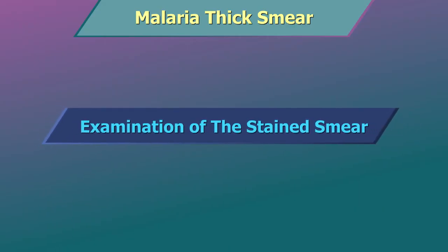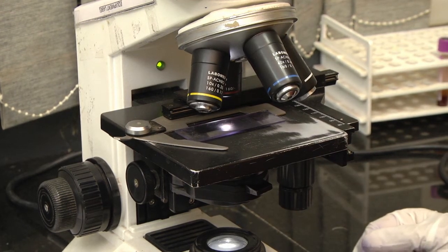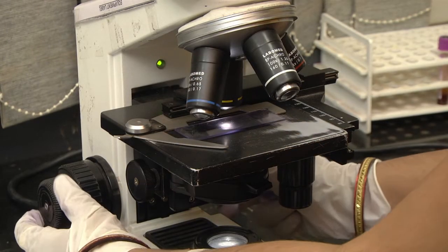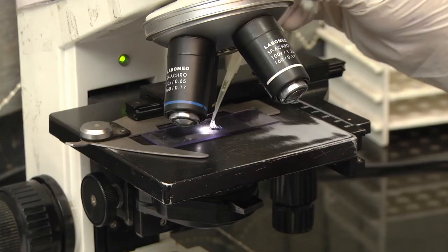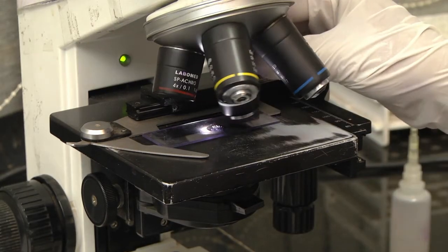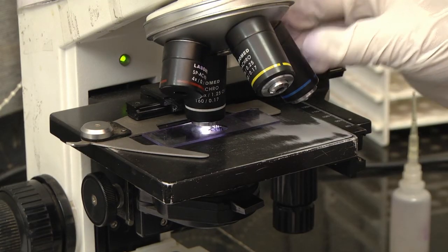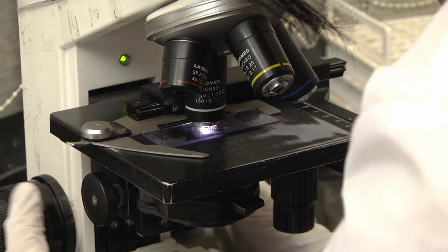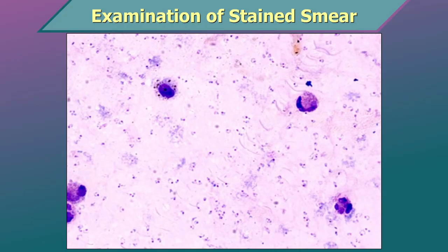Examination of the stained smear: place the slide on the mechanical stage of the microscope. Focus the slide first using the 10x objective. Place a drop of immersion oil on the edge of the middle of the film. Position the 100x oil immersion objective over the film. Lower the oil immersion objective until it touches the immersion oil. Examine the blood film by moving along the edge of the thick smear.